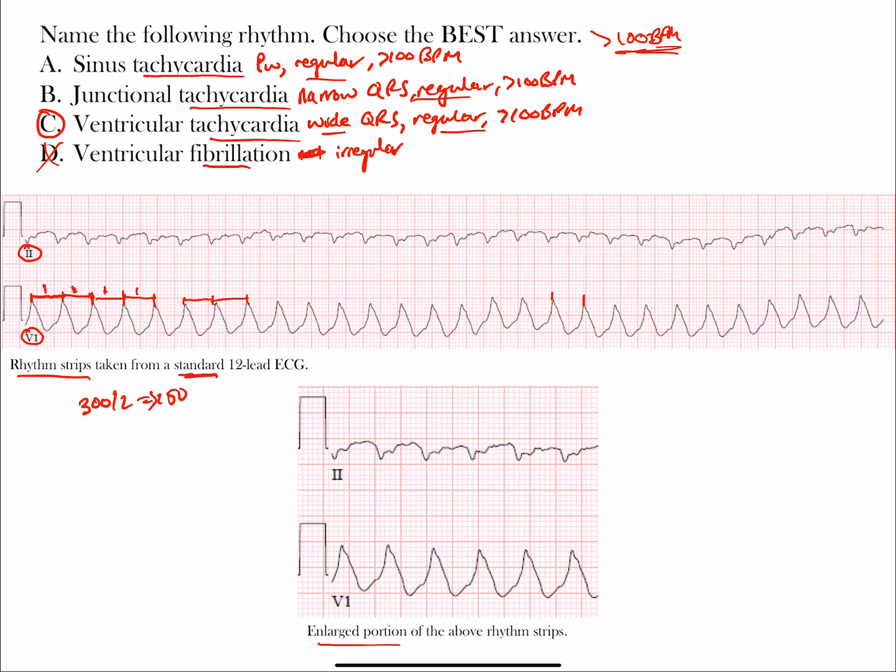You can also count the complexes going across and multiply that by six - that's another way you can do that. The rate is obviously a fast rate, but it's not junctional because the complexes are not narrow. It's a regular and fast rhythm, so junctional rhythm is not correct.